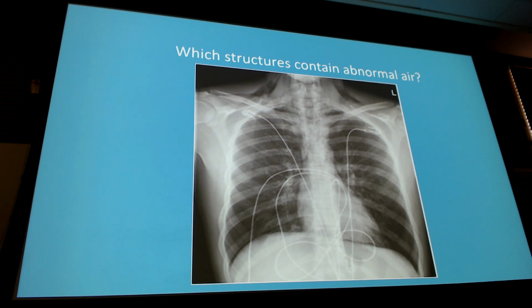It wants to escape. So if I have subcutaneous emphysema without some kind of direct trauma to that area, I want to make sure I'm evaluating for a pneumomediastinum. Or if I have a pneumopericardium and I have subcutaneous emphysema, pneumopericardium plus subcutaneous emphysema equals pneumomediastinum on imaging. You can absolutely have subcutaneous emphysema and just have the pneumothorax like we talked about yesterday. But I want you to take the pericardium part plus the subcutaneous emphysema and say if those two together, that equals pneumomediastinum.